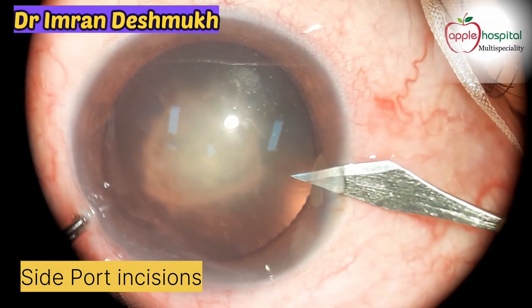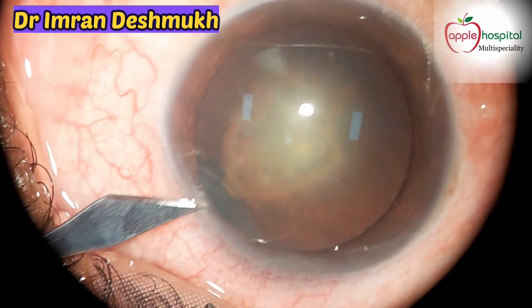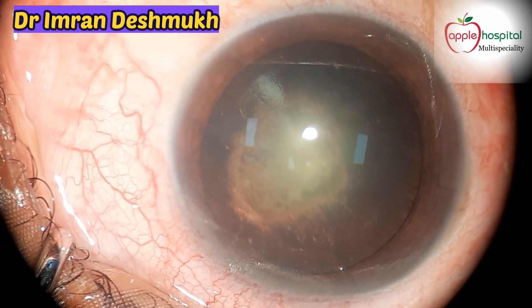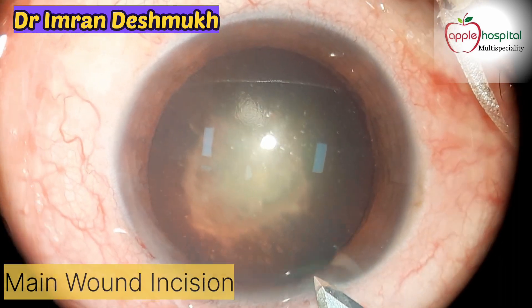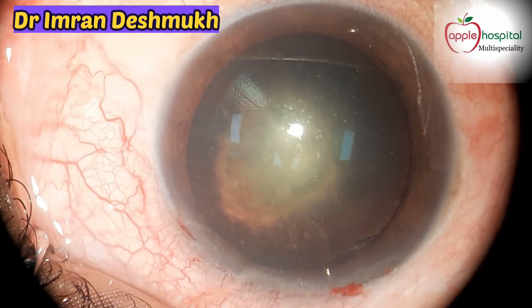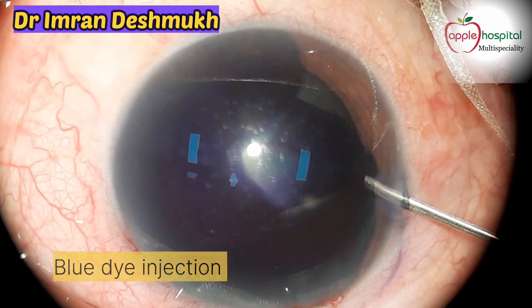We start by making side port incisions 1.5 millimeter in size, 120 degrees apart. There you go — those are two side ports. Now it's time for the main wound incision; we use a 2.8 keratome. This is a biplanar incision — a very well made incision.